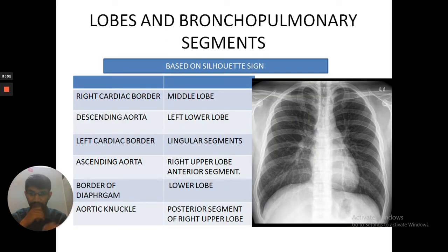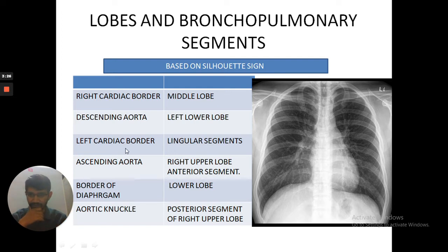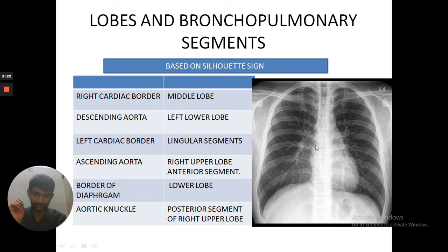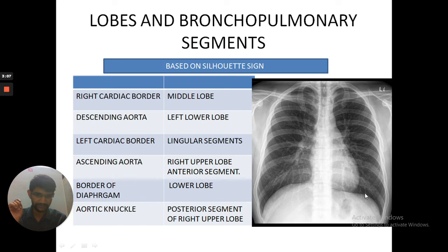Now, how we can apply this sign to identify different segments and lobes — I have made it in a tabular column. If there is a blurring or silhouetting of the right cardiac border, then the right mid-lobe is involved. On the left side, if there is silhouetting of the cardiac border, then the lingular segment of the left upper lobe is involved. If the diaphragm is silhouetted, then the lower lobes are involved.